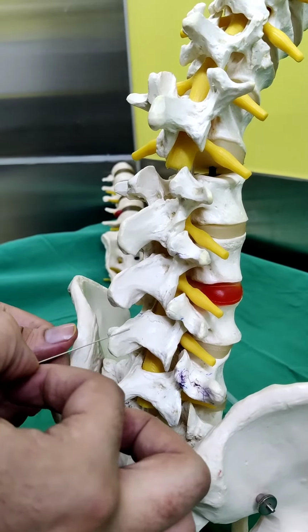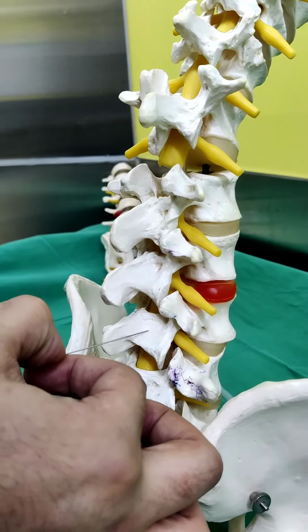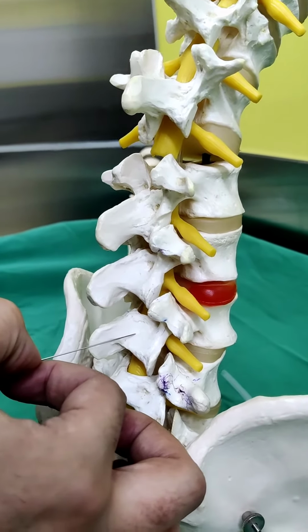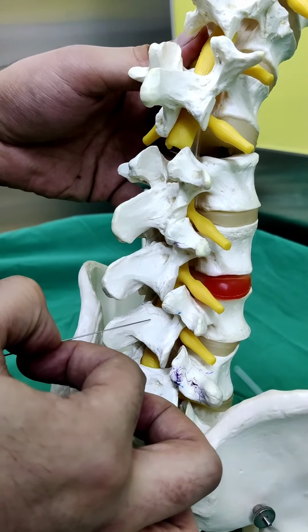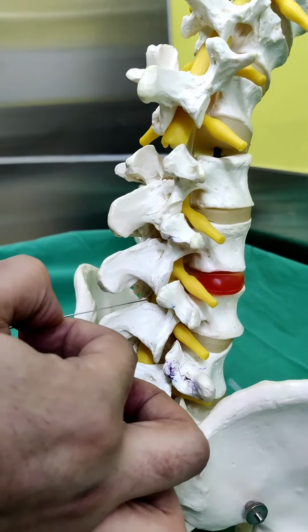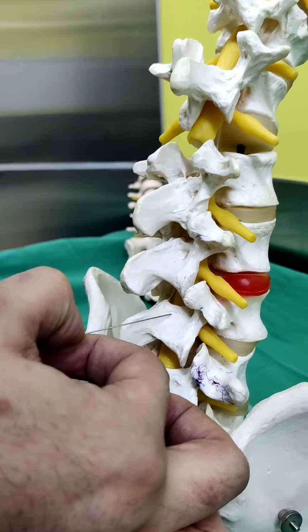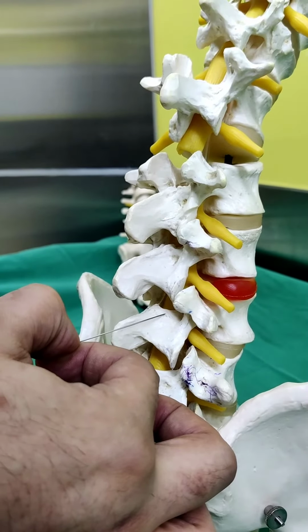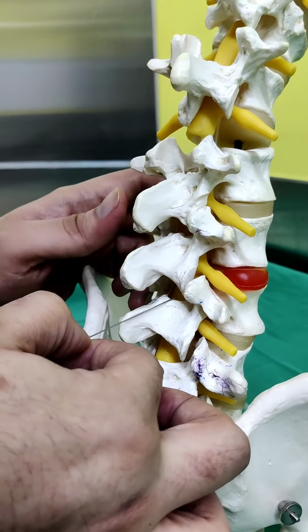Now the second problem which we can face: supposedly we have gone far in and now we are encountering bone. So the problem here is that we are near the space but we are hitting the lamina. To overcome this problem, just redirect your needle up or a bit down so that you are in the space. Supposedly I am hitting the lamina here, my needle is too far in. Now I can just move the needle up and introduce it, and I can easily find the space.